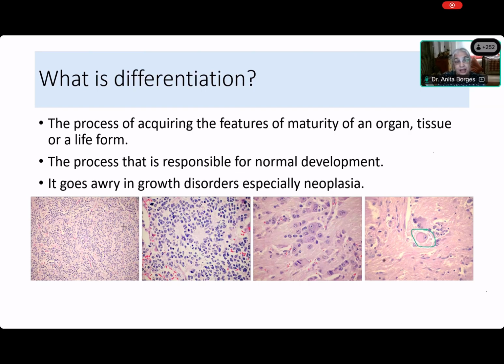And we started off with round cells. Then we saw rosettes. Same round cells, but now they are forming rosettes. In this third picture, Deepak, what do you see? What do you see in the third picture? You're seeing some cells. They are multinucleated cells with a lot of cytoplasm. And in the background, you are seeing these small cells that look like what you were seeing in the first two pictures. Some of them are now beginning to be associated with these big cells, which have very large nuclei with nucleoli, and they've got a lot of cytoplasm.